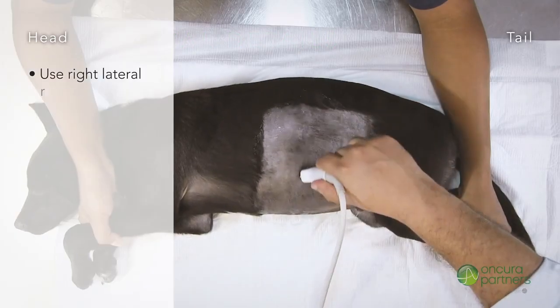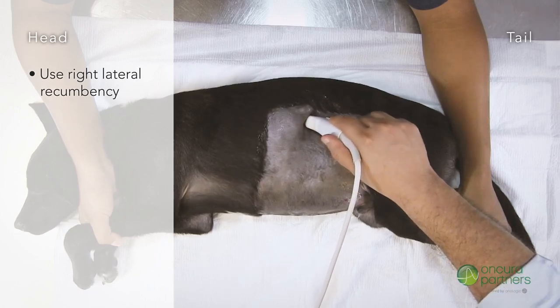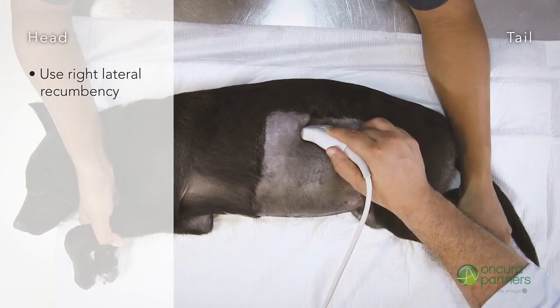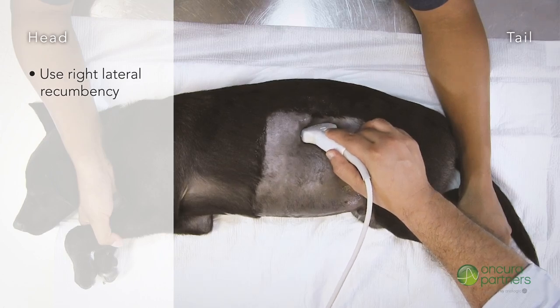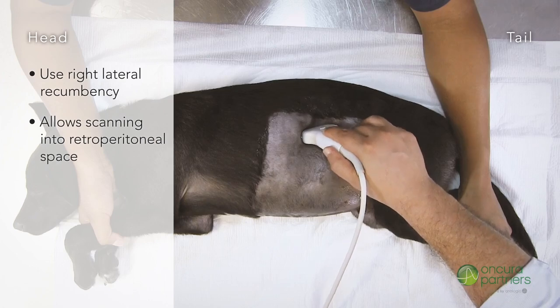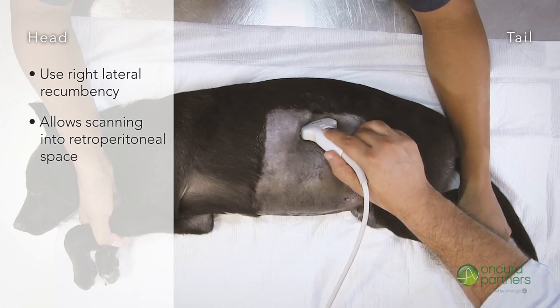Place the patient in right lateral recumbency with its legs directed towards the sonographer. This position will provide a number of benefits when locating the left adrenal gland. Firstly, it will allow the sonographer to scan dorsally into the retroperitoneal space.